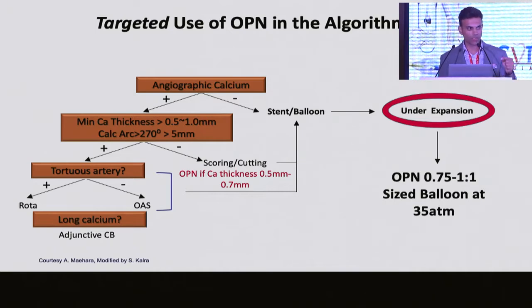35 atmospheres, because what you're trying to achieve is pressure. You're not trying to achieve size anymore. The size you did. This is all about creating cracks.